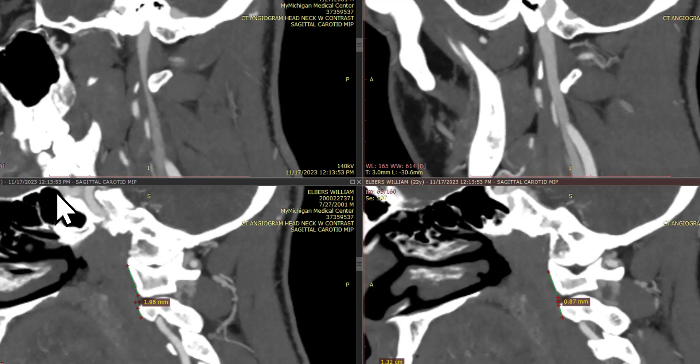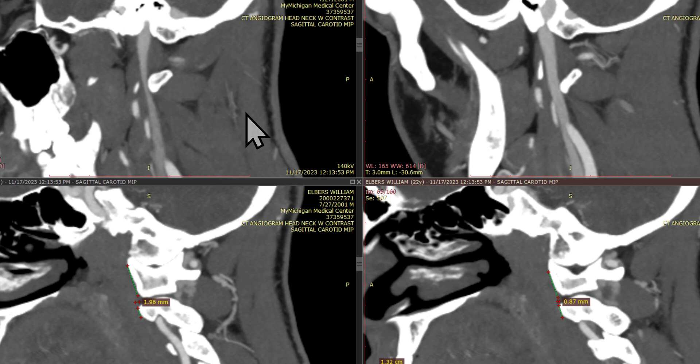Hey, it's Dr. Centeno. Let's take a look at internal jugular vein compression and why in CCI patients this is a dynamic phenomenon, or usually a dynamic phenomenon. So here we have a CTA.